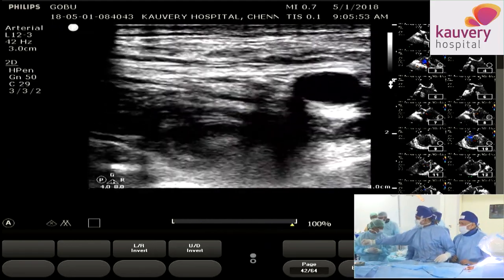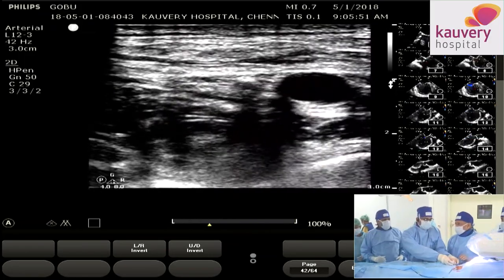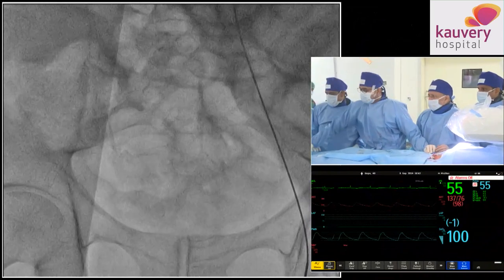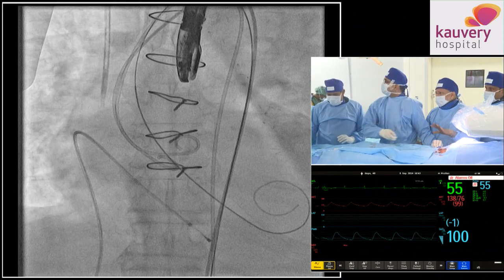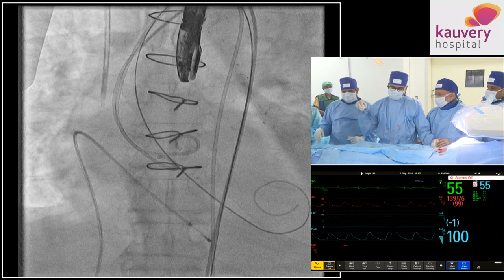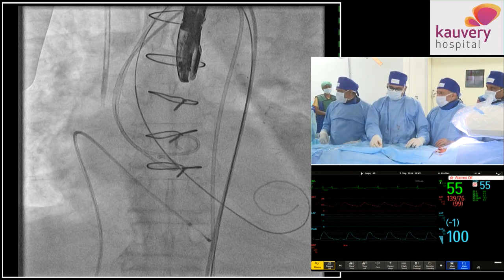So, Saibal, this is an extreme situation. And in this kind of situation, we have made these kind of adjustments to make this case happen. And as I said, we are not saying that you don't do a CT anymore. So in this kind of situation, this is the alternate pathway to treat this kind of case where the creatinine is very high, and we minimize the contrast.